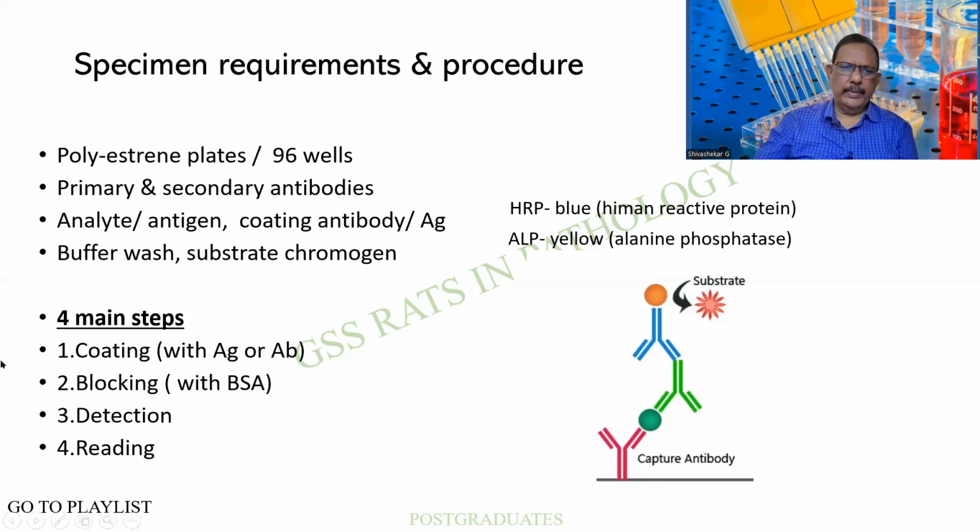There are 4 main steps. One is coating of the wells with either an antigen or an antibody. Second, blocking so that non-specific substances are not getting attached. Third one will be detection. And fourth one is reading.